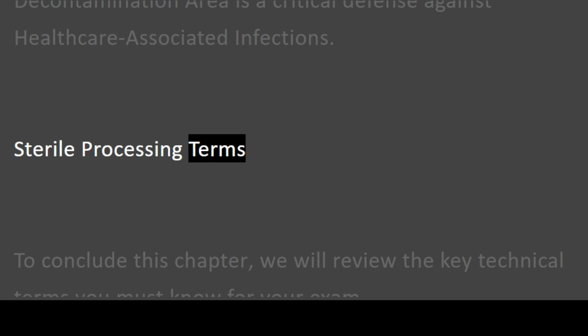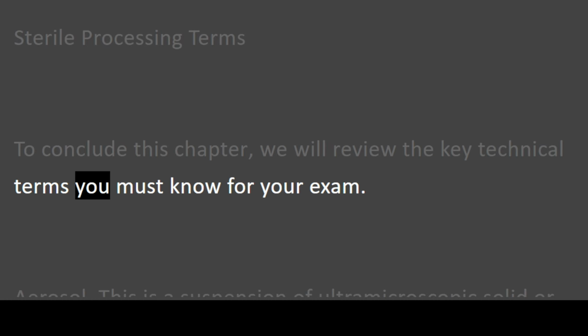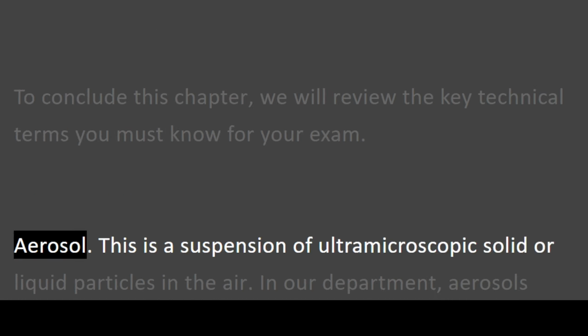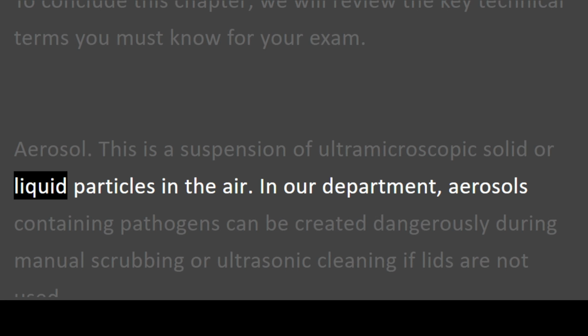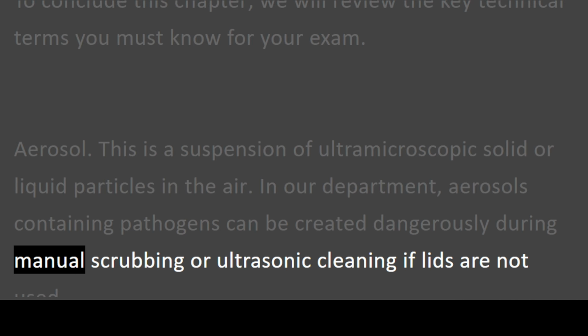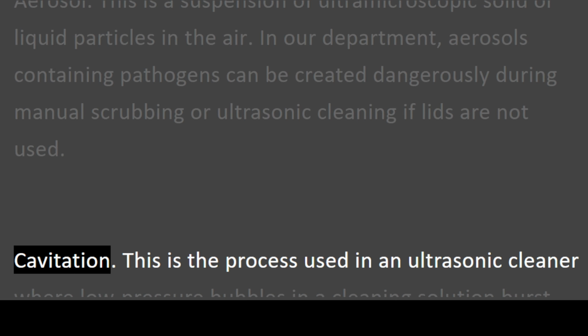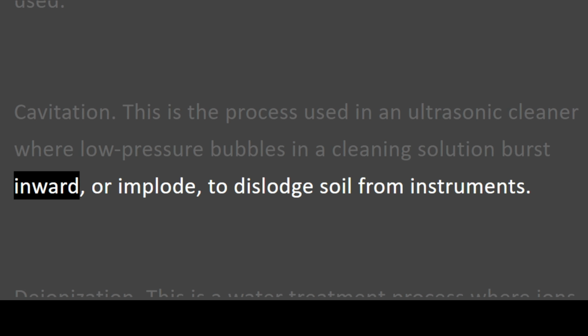Sterile processing terms. To conclude this chapter, we will review the key technical terms you must know for your exam. Aerosol. This is a suspension of ultramicroscopic solid or liquid particles in the air. In our department, aerosols containing pathogens can be created dangerously during manual scrubbing or ultrasonic cleaning if lids are not used. Cavitation. This is the process used in an ultrasonic cleaner where low-pressure bubbles in a cleaning solution burst inward, or implode, to dislodge soil from instruments.